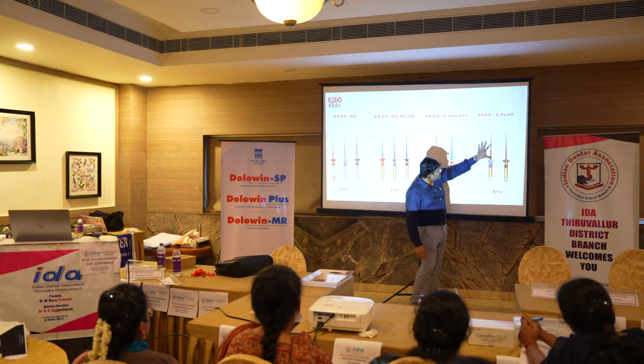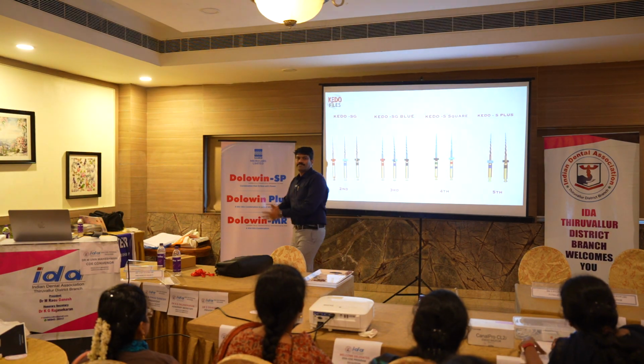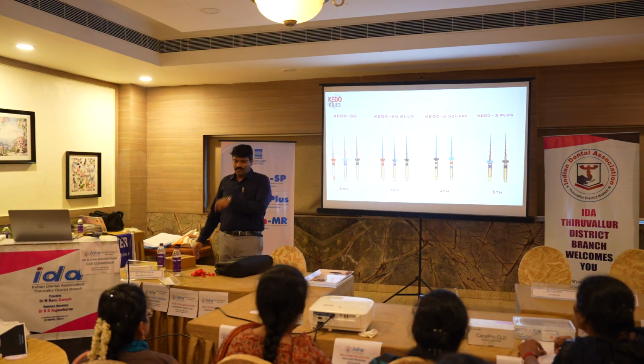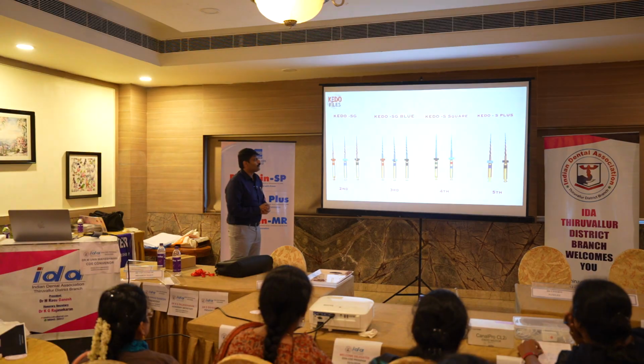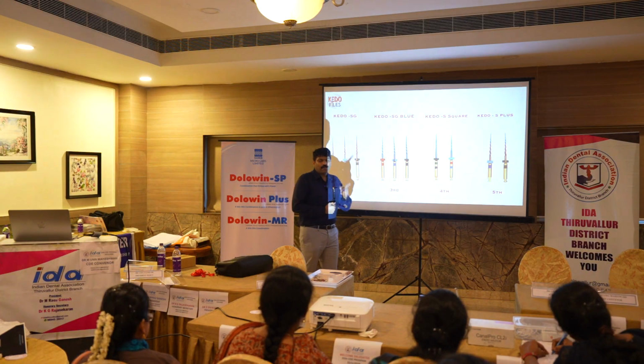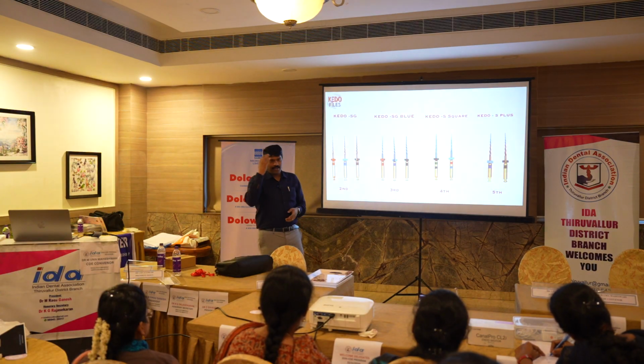Now you see gold and blue. Why? Flexible. This is coronal. Why? Coronal is gold. I asked you one question, why ProTaper company has not come with blue files? Take it in your mind.